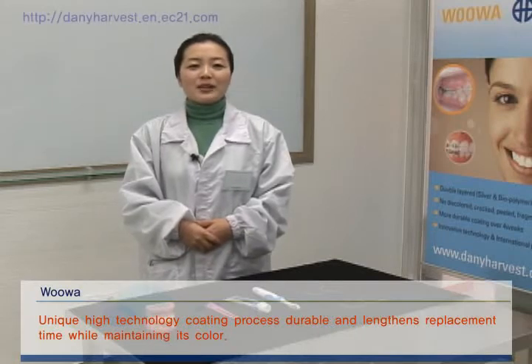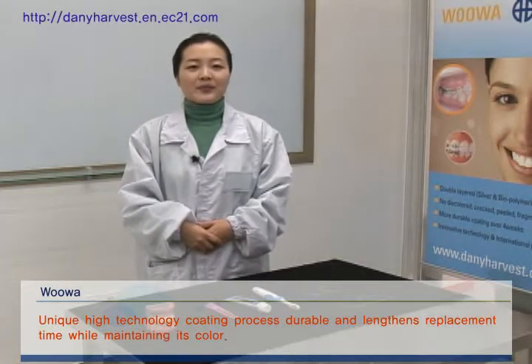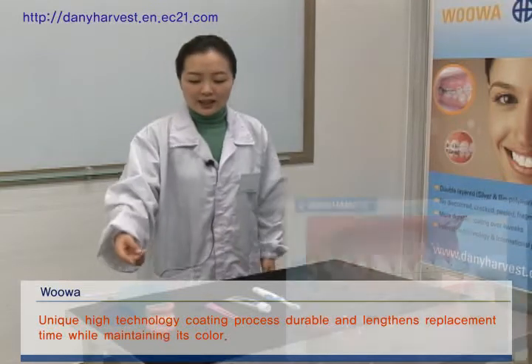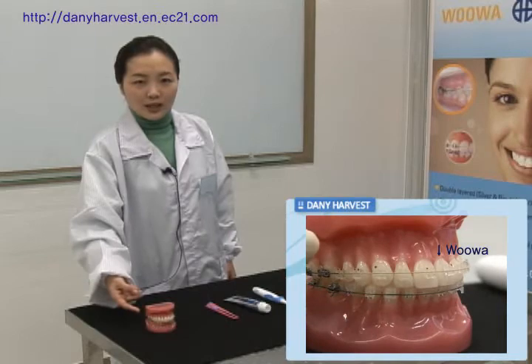Hello, I'm happy to introduce UWA, Aesthetic Orthodontic Archwire. This is regular stainless steel archwire, and this is UWA, as you see in the upper teeth.